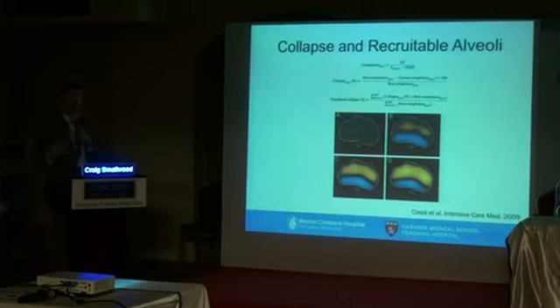So that's, I think, a consequence of a pulmonary recruitment: in order to recruit alveoli, you're going to have to sacrifice some of the healthy ones in the interim in order to open up those alveoli. So we see that we're causing a lot of overdistension, lots more overdistension, but we're starting to see resolution of the alveolar collapse in the dorsal region. And that is really a key region, I think, that's coming out in the literature, and I'll show you some of my experience in a few minutes.